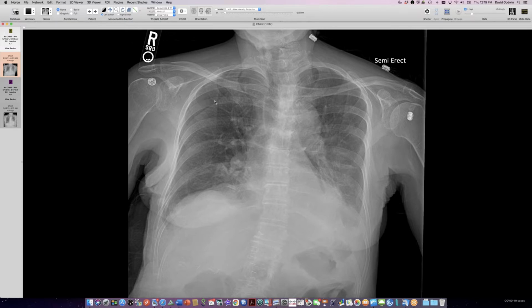So these are skin folds. We've got a skin fold here and a skin fold here. I thought this was a good teaching example, because you can compare the findings of skin fold, which can mimic pneumothorax, with actual pneumothorax. First off, an actual pneumothorax is a thin white pleural line between black underlying lung and black pneumothorax outside. So it's black, white, and black, whereas a skin fold is just whiteness, usually increasing whiteness going up to sudden blackness. So we don't have a thin white line here, we just have an interface, white meeting black. It's often increasing whiteness on the way to black.